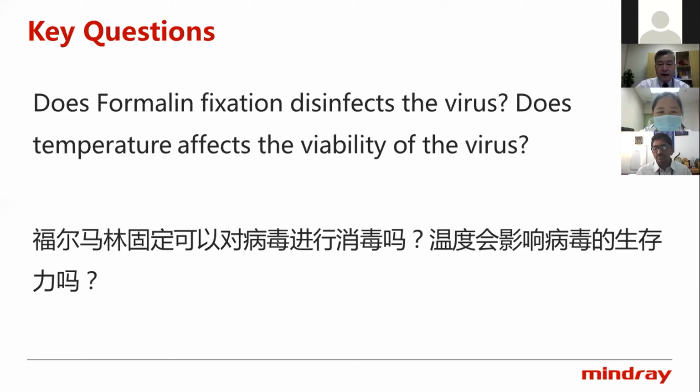This is our experience. Secondly, for specimens collected from the enclosed environment, such as blood specimens and urine specimens, relatively speaking, the risk level is lower than those collected from the respiratory tract. This is my supplement. Thank you.